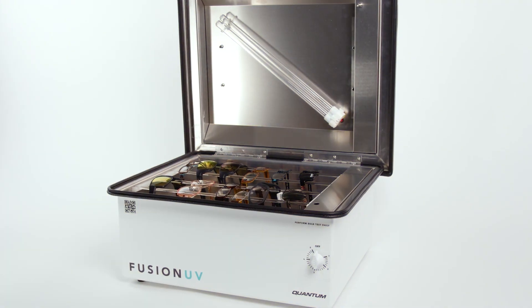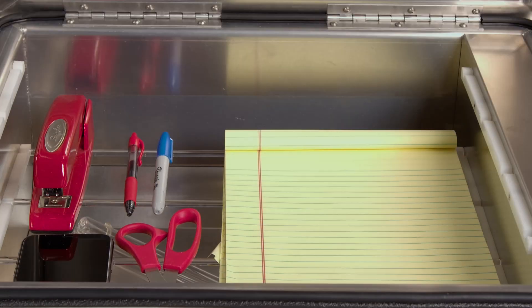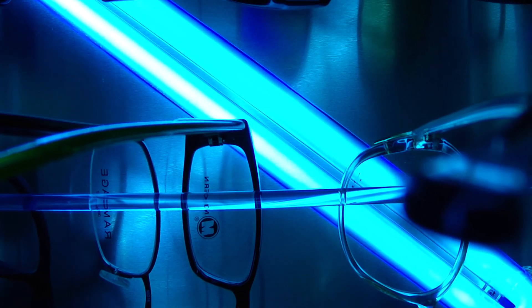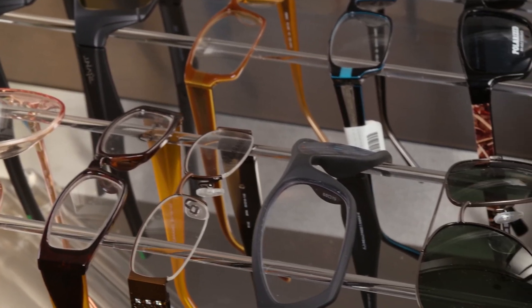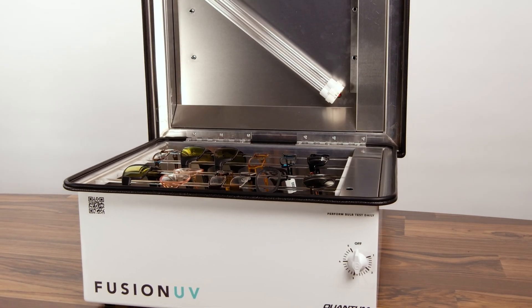The Fusion UV is the ultimate antiseptic tool, keeping lenses, frames, masks, and tools sanitary and protected. Using UV light, the Fusion UV blasts short wavelength UV-C waves, which inactivate bacteria and viruses in minutes, generating minimal heat and no damage to frames, lenses, masks, or tags.